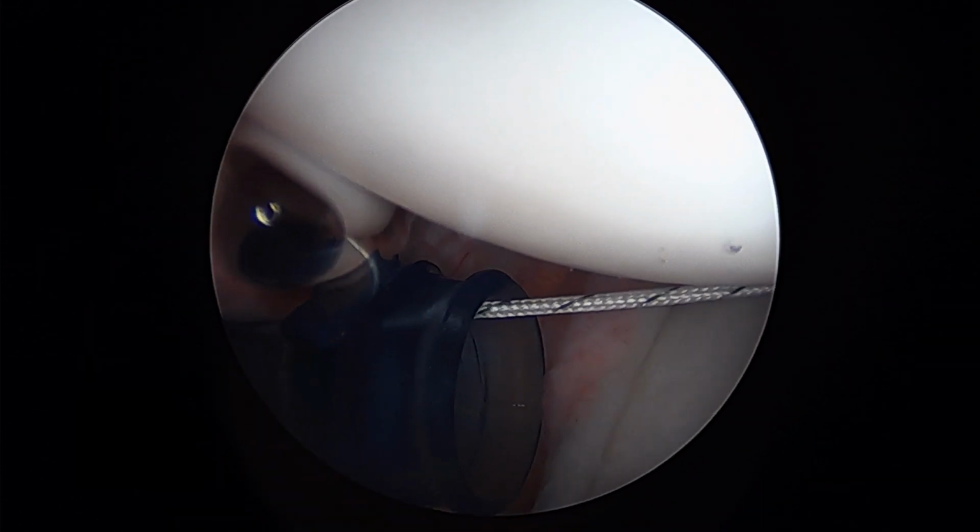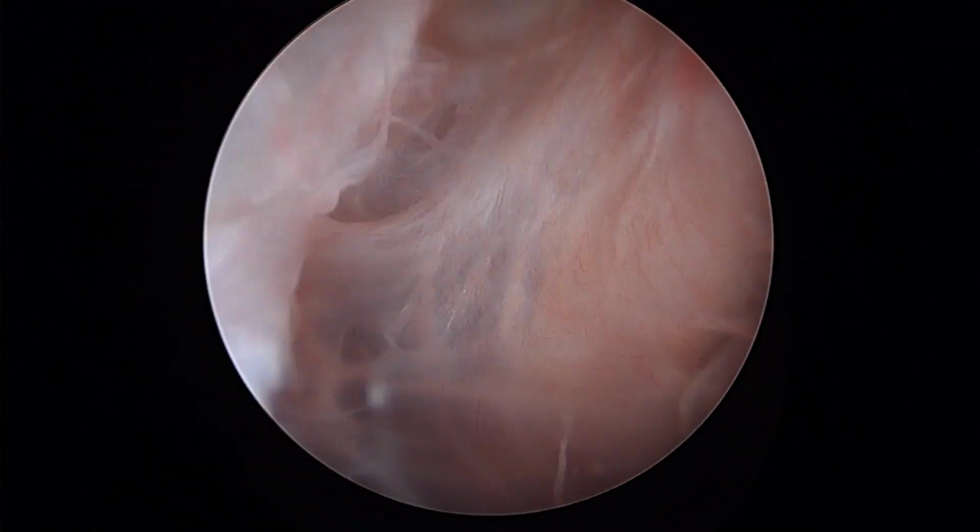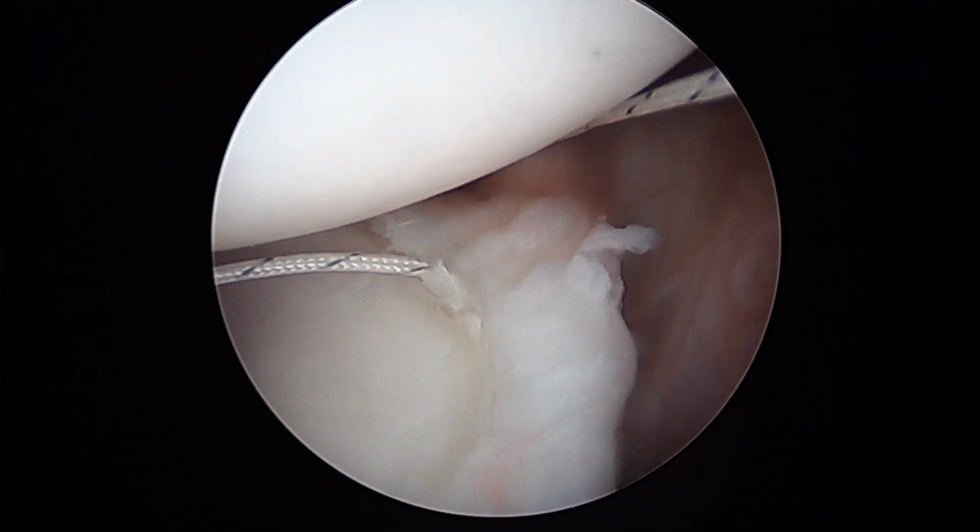So now you'll see a different type of mattress stitch. And we're going to pass that a little bit above. Again, we're just trying to close down all this volume. See all this volume here? That's why the shoulder's dislocating.